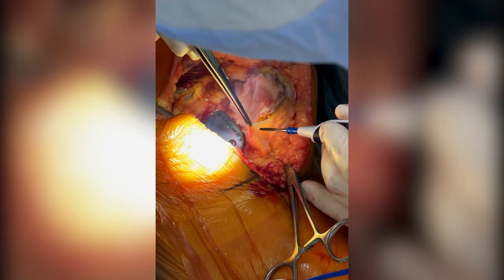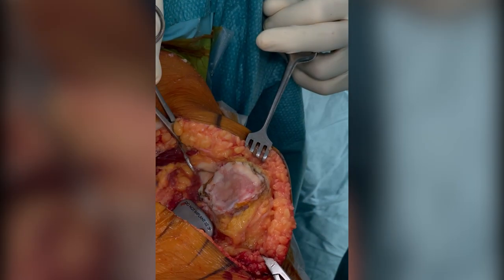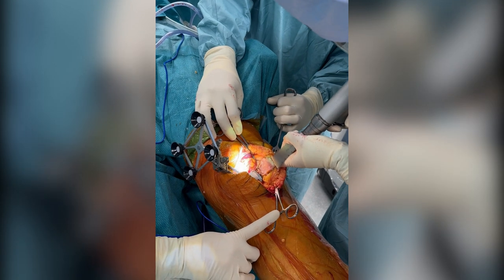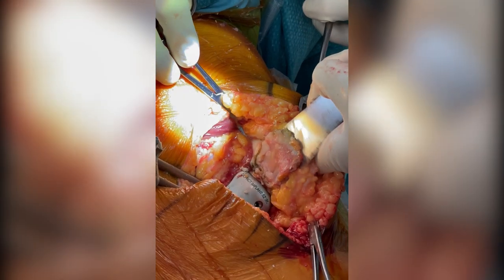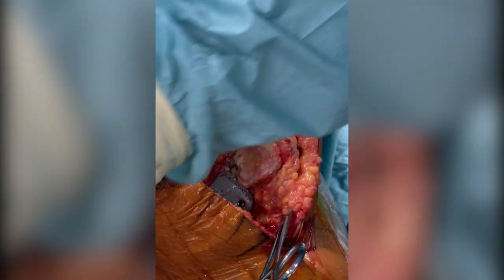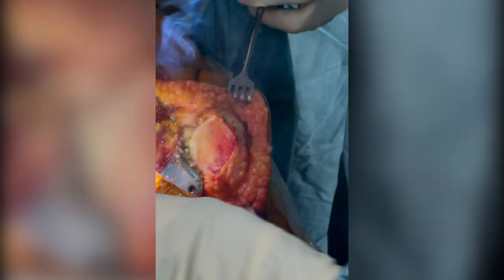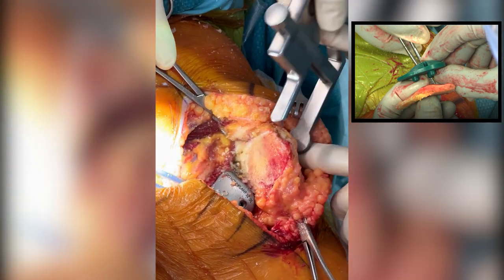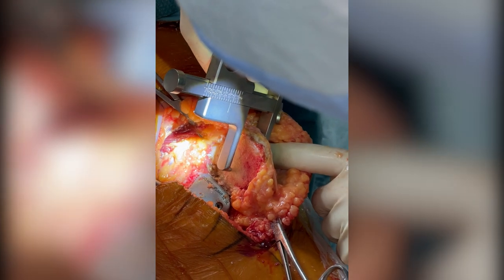Let's concentrate on the patella now. First, remove some of the inflamed synovium surrounding the patella — you can see the fully worn cartilage there. We're measuring the thickness before and after the cut, then a standard pneumatic saw cut. The target is to restore the exact thickness of the pre-arthritic condition of this kneecap — usually around 22 mm for a female patient, around 24 mm on average for a male patient, depending on the morphotype and size of the patient.